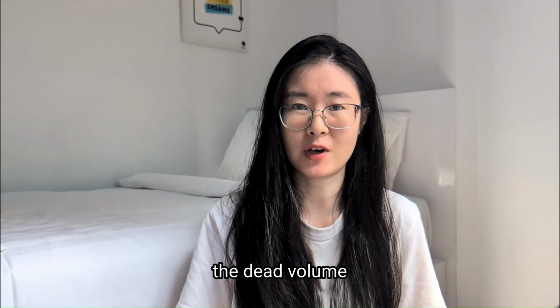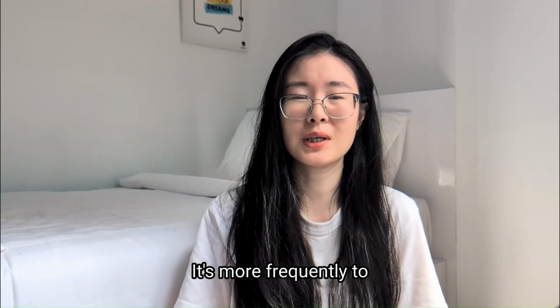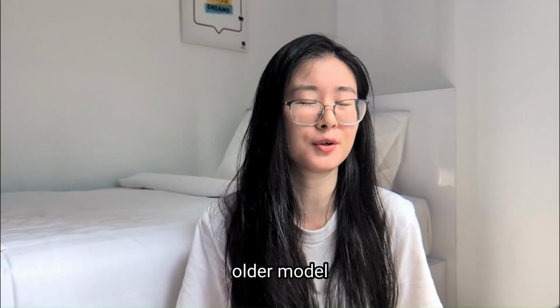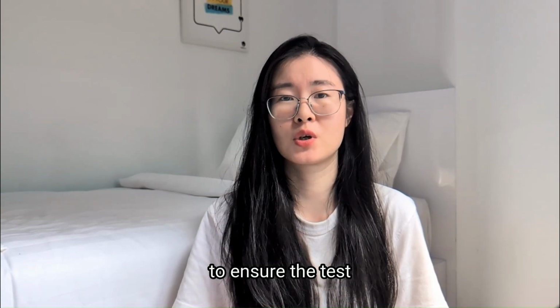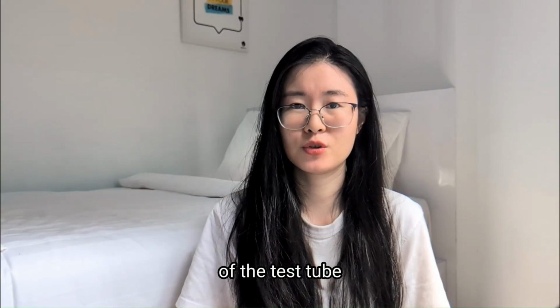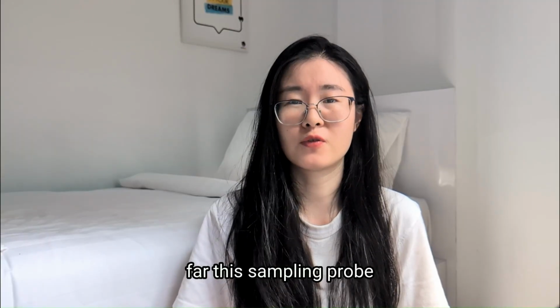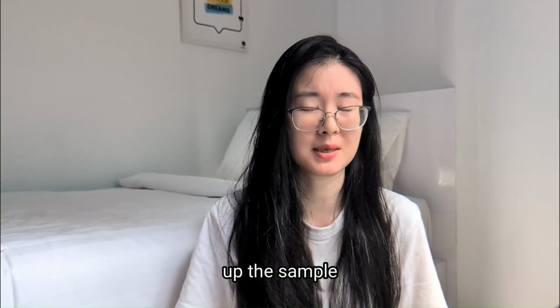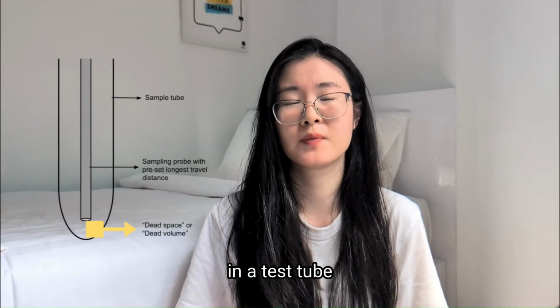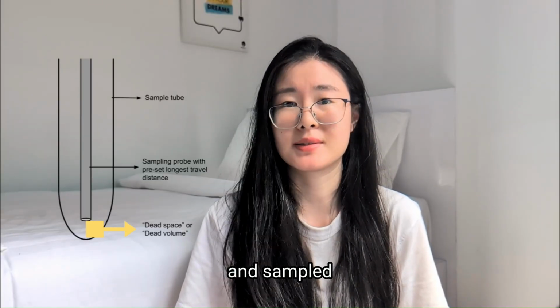So first, the dead volume. This does not apply to every single lab, every single analyzer. It more frequently happens in a smaller hospital in a rural area with a relatively older model. Some of the analyzers, to ensure the test sampling probe does not go all the way down to the bottom of the test tube and crush it, have a fixed position for how far the sampling probe will travel to pick up the sample. That safety measure is the reason you will have dead volume in a test tube. There will be some liquid at the bottom of the test tube that cannot be picked up and sampled.